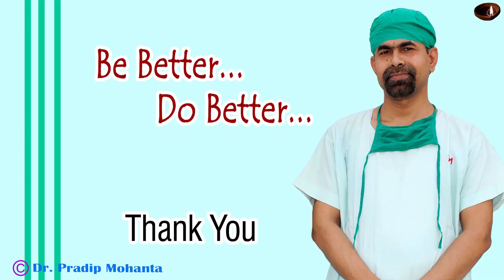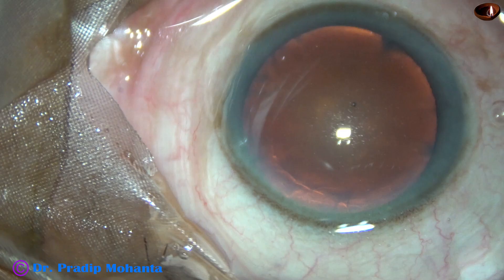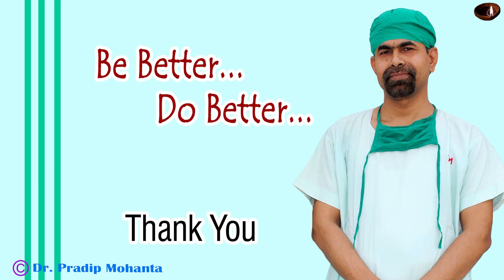Thank you very much for your attention. I hope this video will encourage you to use a pre-chopper, particularly in soft cataracts where you cannot hold the nucleus firmly — like grade 1, grade 1+, or grade 2 nuclear sclerosis. In such cases, you cannot hold the nucleus firmly with vacuum. You can use this pre-chopper. There are other ways also, like mechanical chopping without using vacuum, or you can tilt the nucleus making the rhexis a bit larger. Be a great surgeon and serve your patients with love, respect, compassion, and great surgical skills.